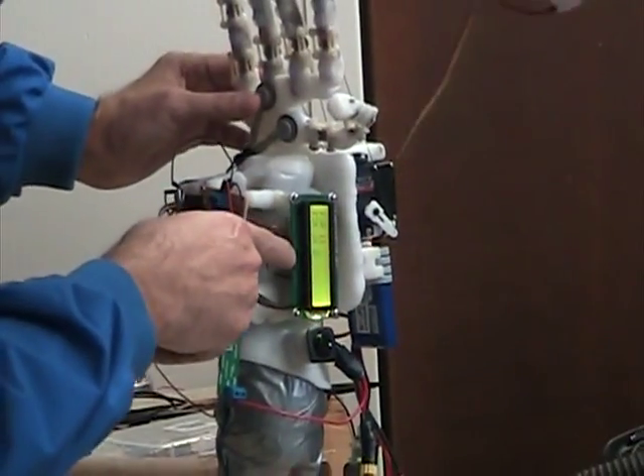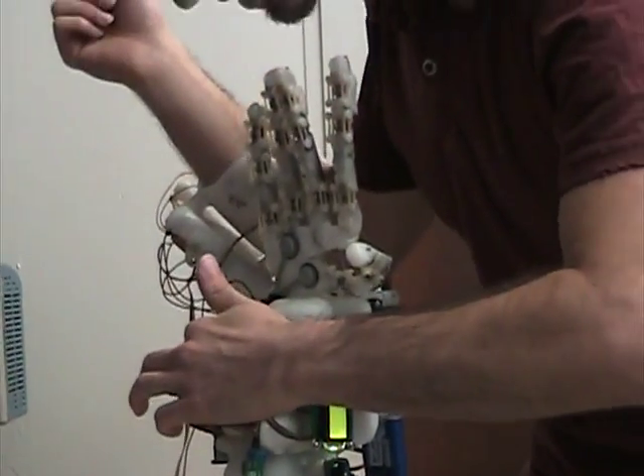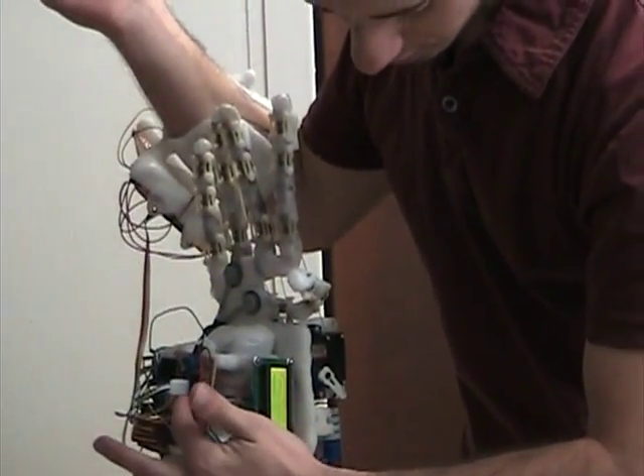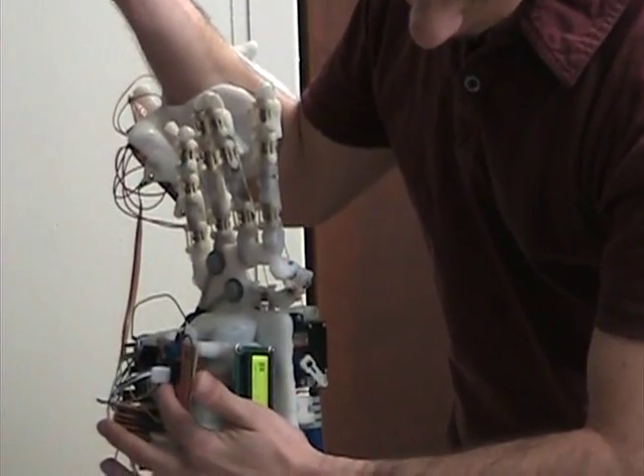So this is the sensors themselves. It's not on — I mean, I deactivated it. I'm going to put it on. And this will display the FSR.